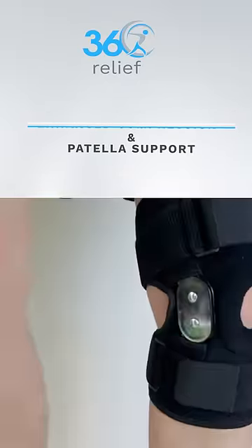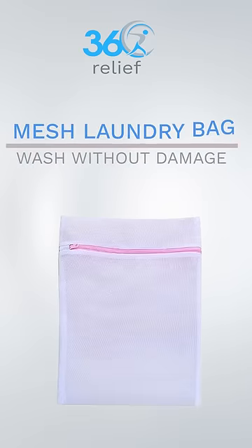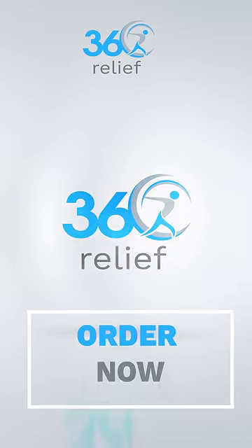Comes with a mesh laundry bag to allow you to wash your knee support without any damage. 360 Relief — order now.